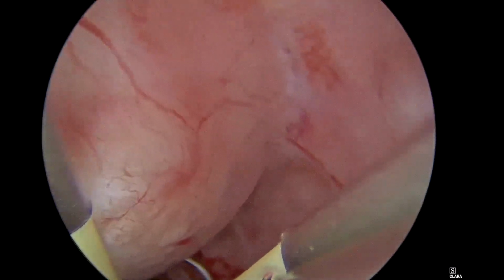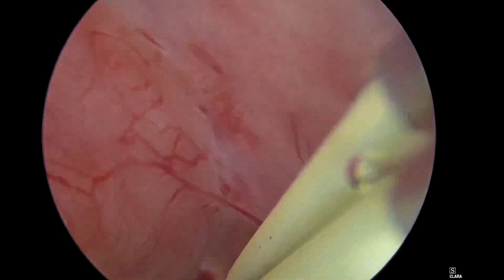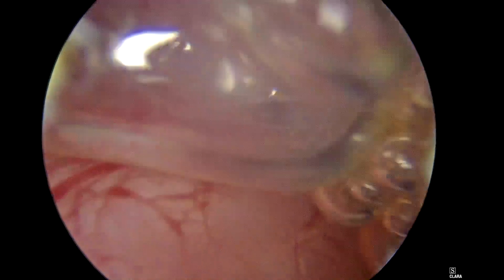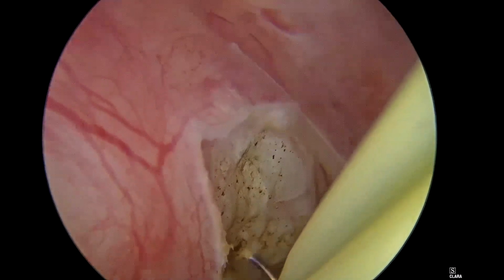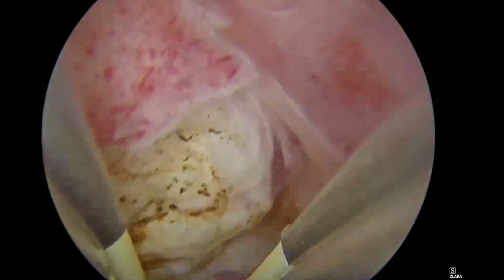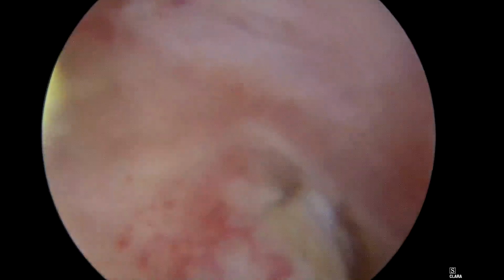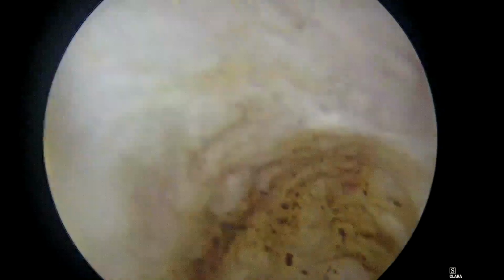Well, everything was going fine, and then I started the resection, adjusting the bipolar power to test how the electrode is gliding. Now you can see showers of gas bubbles. This is a phenomenon that I observed especially with bipolar, which is much less likely to happen with monopolar. We know that the monopolar risk is the danger of using glycine, the non-electrolyte solution. That's why everybody escaped from using it. I do agree on that. But on the other side, you see the showers of gas bubbles.